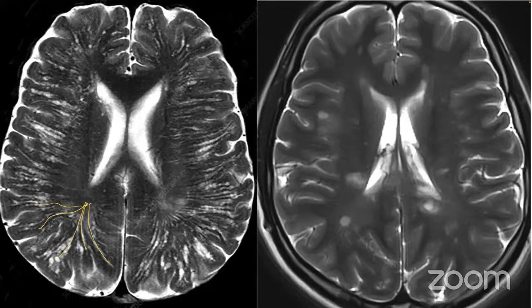So for example, this lesion is happening within this curve, and this one is likely occurring within that field, and this one is radiating this side. This one is happening within a radiation of that pattern and that pattern. And this is really a very helpful diagnostic clue. We're not speaking about that today, but just to give a hint of that.